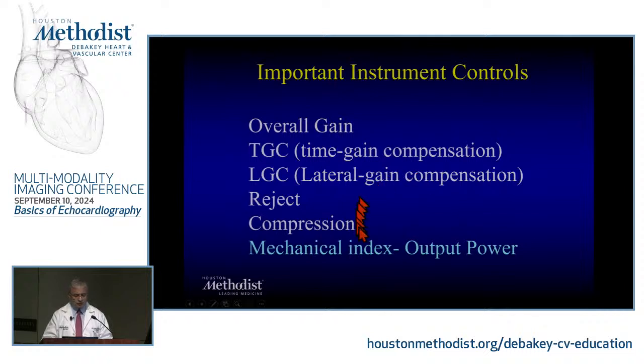There are a lot of controls, so we're not going to go through each one of them, but there's overall gain, time gain compensation. Remember, anything that you do is time related, okay? So the depth that you're talking about is time gain compensation, basically depth, lateral gain compensation, reject, where the lower frequencies are taken out, compression, and there is a mechanical index. In the past, we didn't pay as much attention.